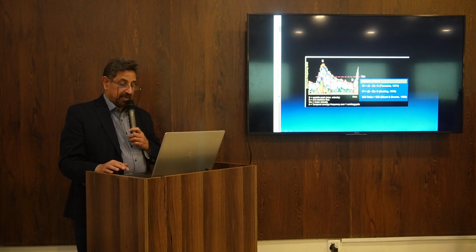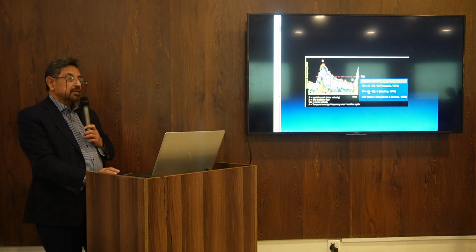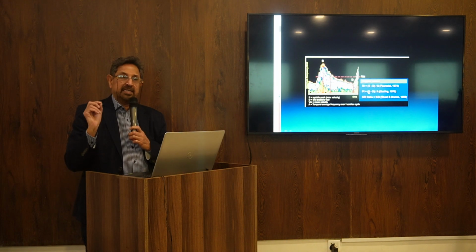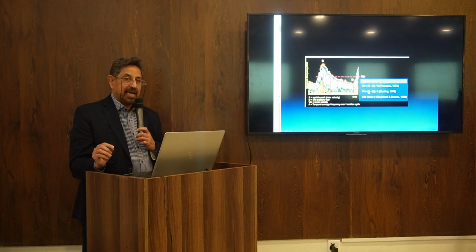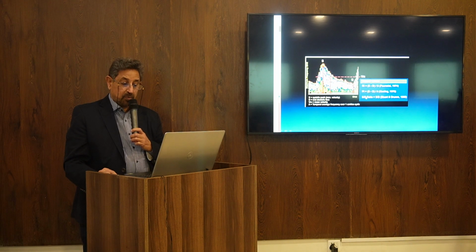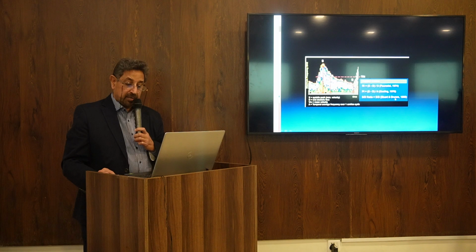To measure, number one, we measure the velocity. To measure the velocity, we need a definite angle. But if you are not getting a proper angle at certain places, then you won't go for velocity, you will go for these ratios. But the angle should be less than 60, otherwise you go for ratios.